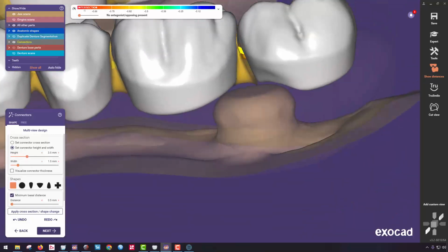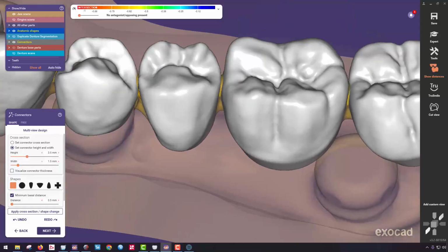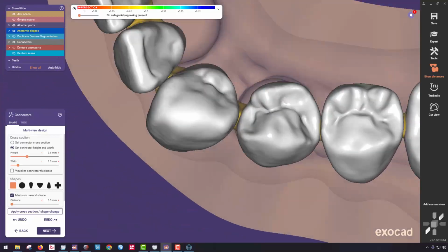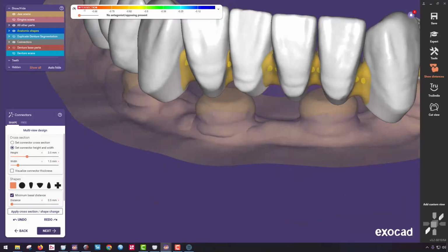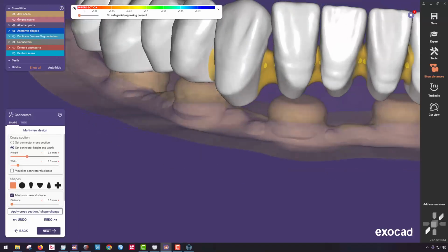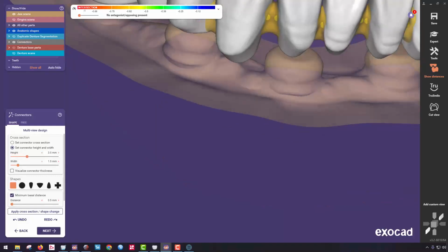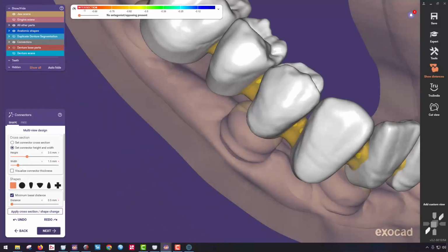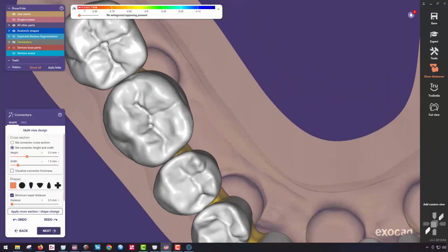And all of these connectors, I usually move them around manually just to make sure that they're not interfering with the aesthetics or the position of the tooth. And then usually that fixes the position of them. So that way they're not interfering, like right in here or right in there. Perfect. And that's a little bit heavy right in there, a little bit heavy. Perfect. I don't want to be in the aesthetic zone. Overall, that looks good.